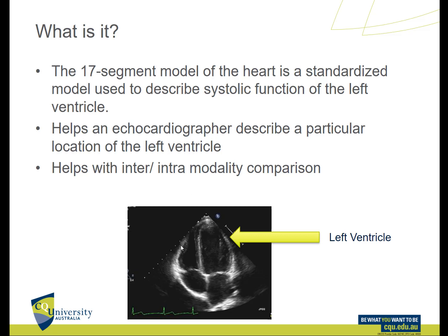Let's say I was doing my scan and this person had had a heart attack and part of their myocardium was thinned. It's akinetic, it's not moving. How would I describe that? How would I describe this exact segment right here? We need to be able to.